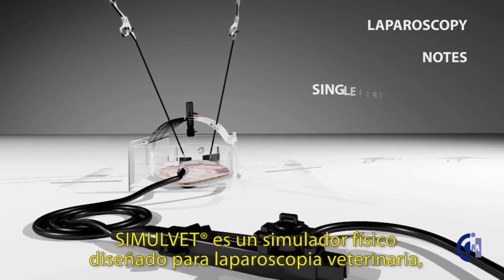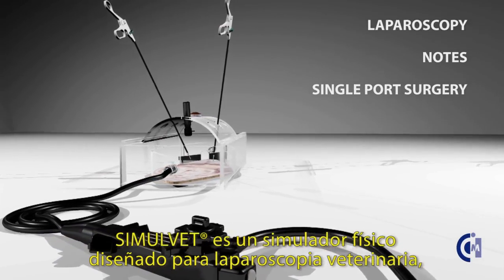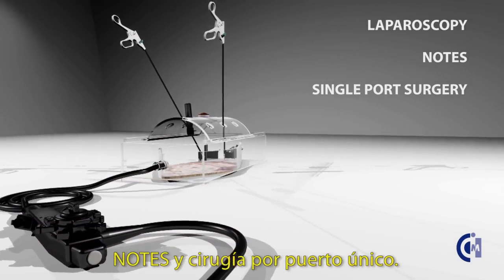The SimulVet is a physical simulator designed for veterinary laparoscopy, notes, and single-port surgery.